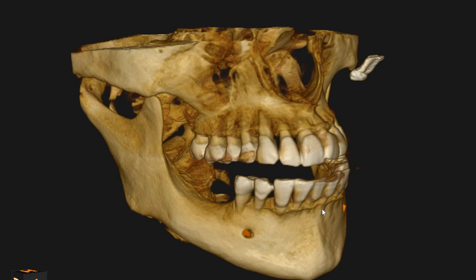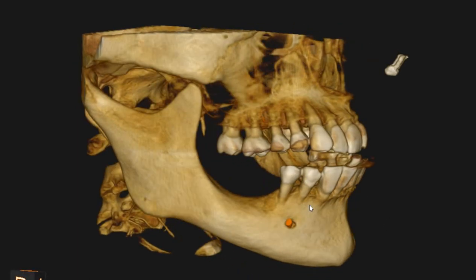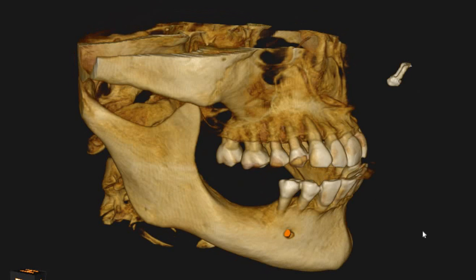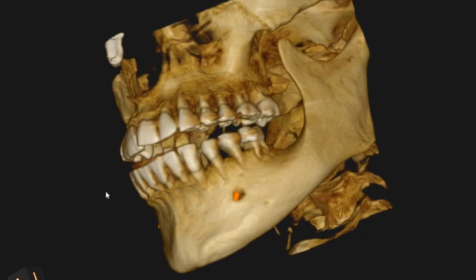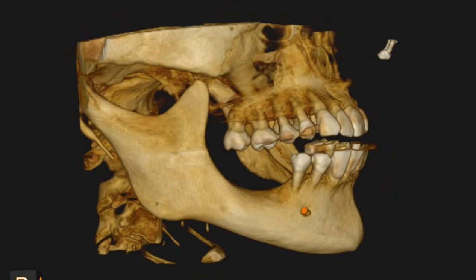Hello and Assalamualaikum, Ultrascan Diagnostics here. This is the CBCT of the patient that you had requested. The area of interest is the lower right and lower left posterior regions.